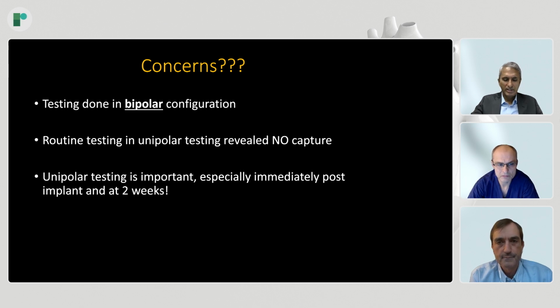Thank you. So we also had 2 perforations within 24 hours, and all were detected because of our routine testing, both unipolar and bipolar. But I was concerned that many were programmed to bipolar pacing. So our institution, as a policy, has changed everything to program to unipolar pacing. And we've also learned that anodal capture does not add significant value in terms of improving hemodynamics, at least in the cardiomyopathy patients. So we don't lose much by having a little bit of right ventricular conduction delay.